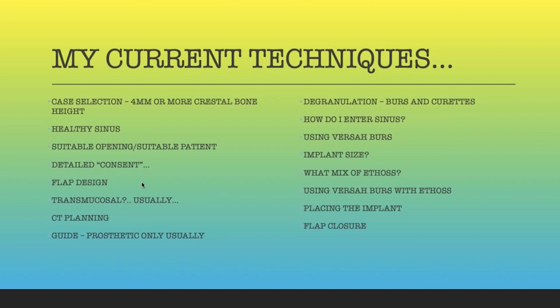My current techniques, I think this is an important part of tonight's webinar. For me, I need to have 4 millimeters or more crestal bone. I need to have a healthy sinus. By that, I don't mean no visible sinus lining. I do cases where you've got some city sinus. So many people who live in urban environments have slightly thickened sinus membranes. That's different than having an unhealthy pathological sinus that's creating symptoms.